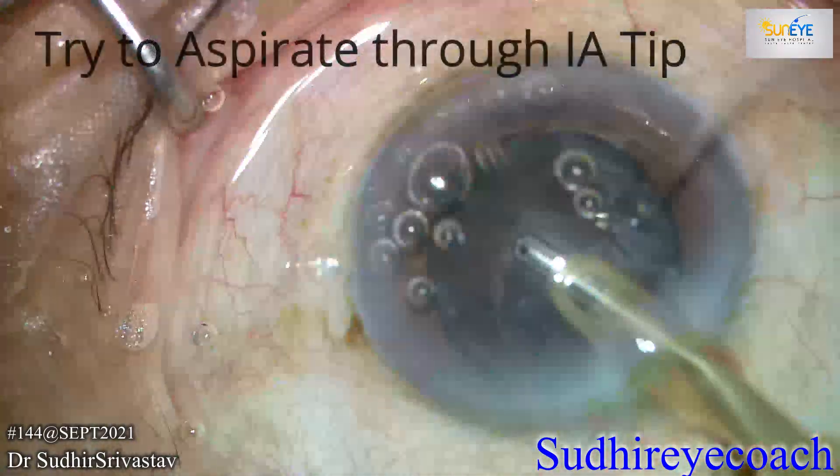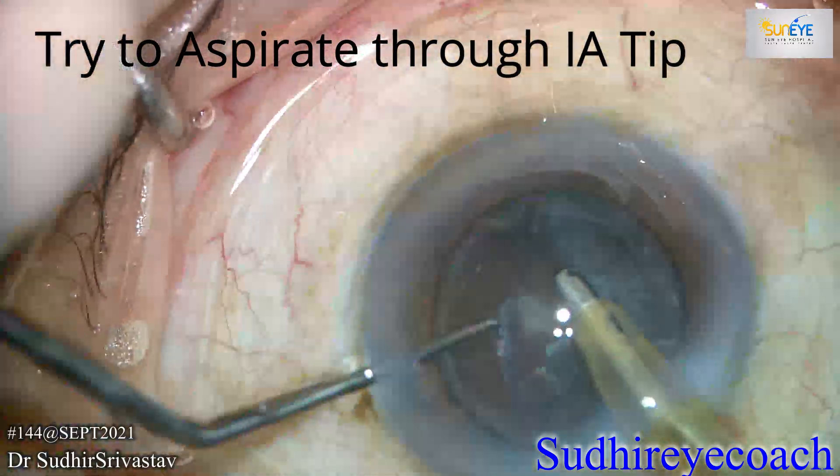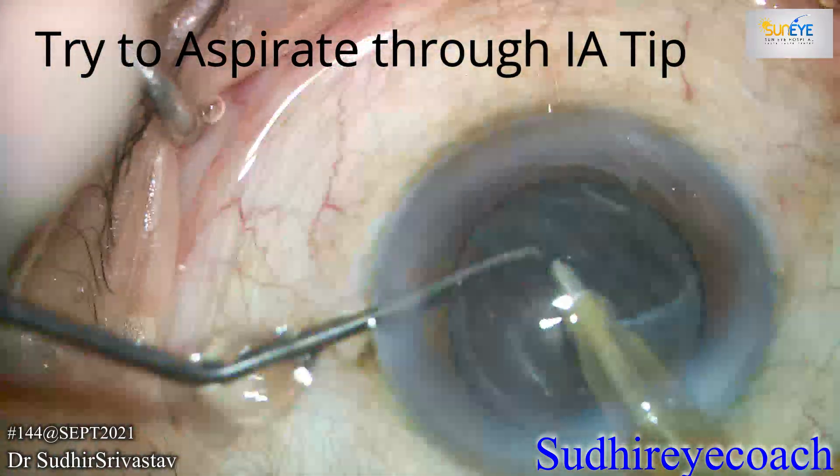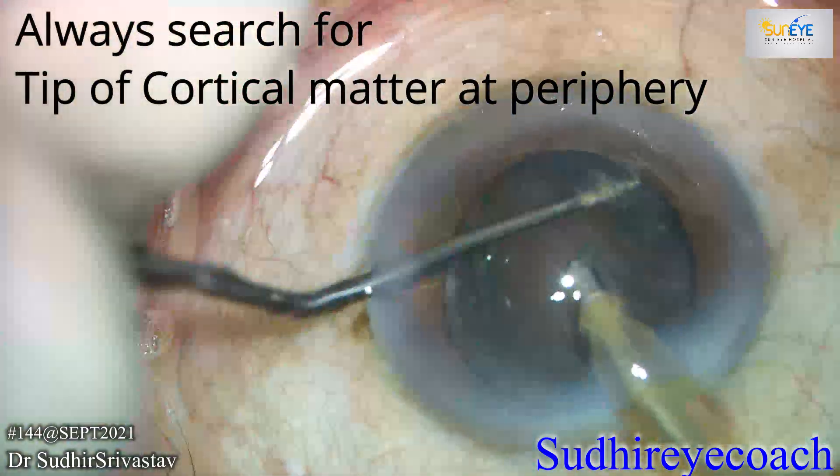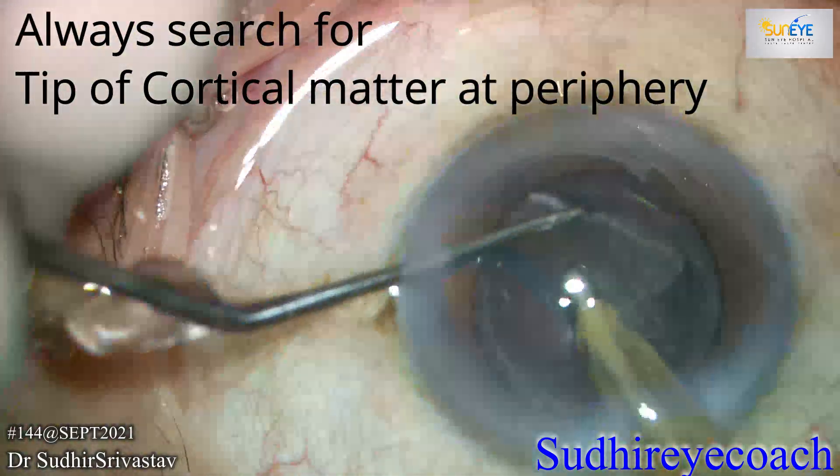But sometimes a bulky epinuclear plate is left and it is not safe to remove it through the phaco settings, even with the lower settings. In that case, you can use the IA tip for aspiration.